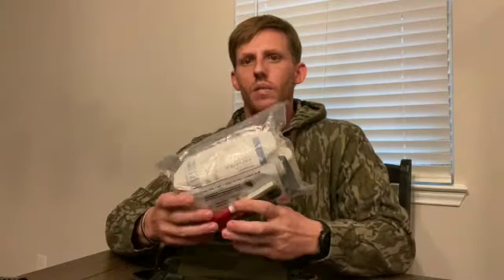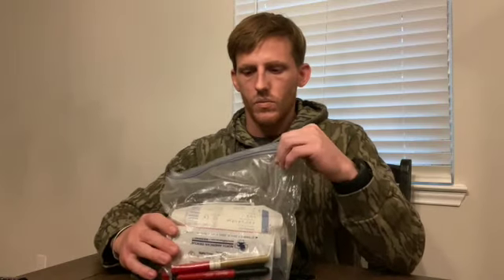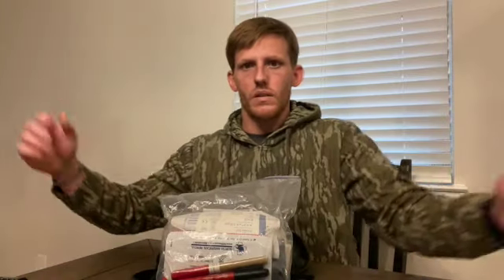So I keep everything in a Ziploc bag for a couple of reasons. One, it keeps everything compact, nice and clean, and when I open the bag, things aren't just flying out everywhere. It also helps with the sterility — it helps keep everything clean and sterile.